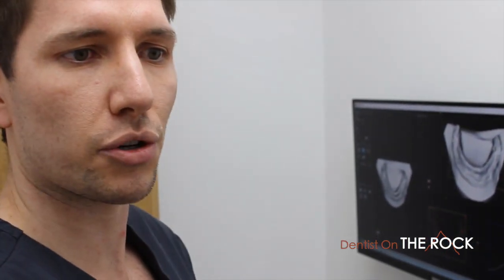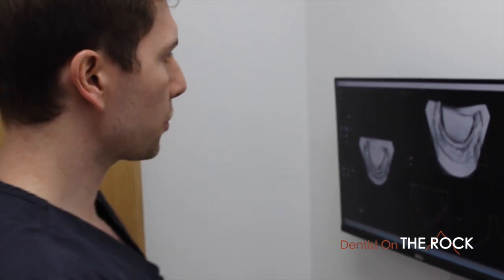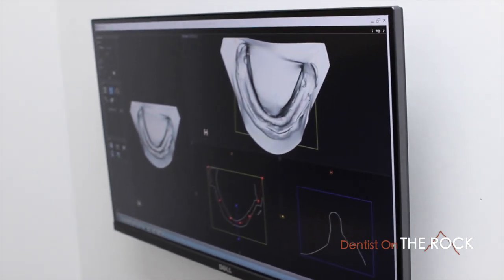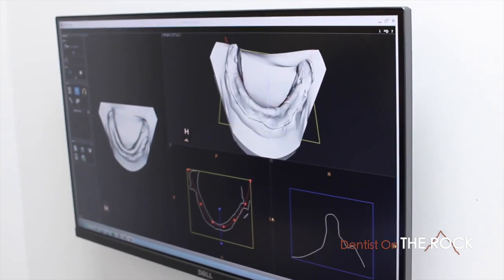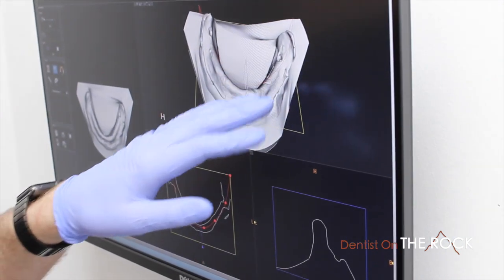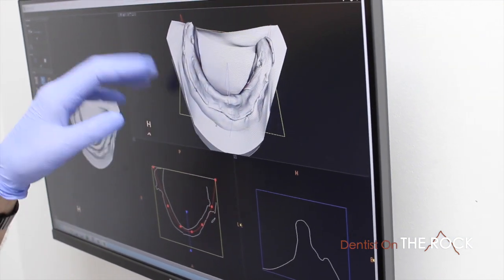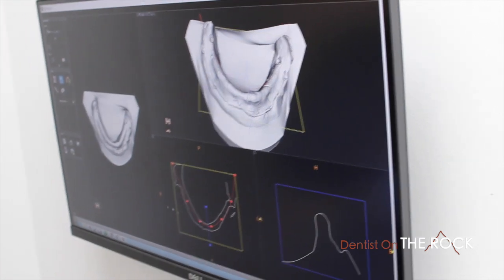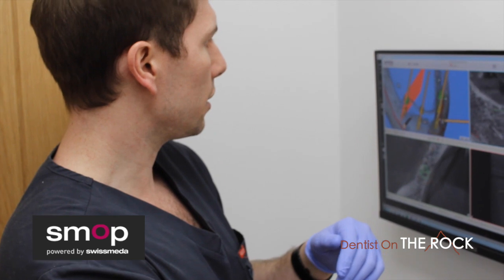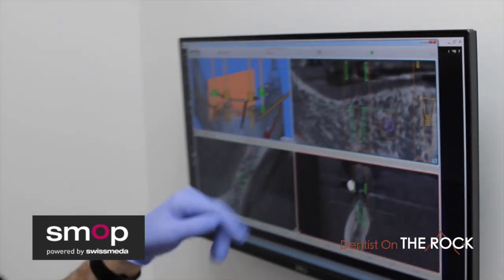You've seen how the model can be scanned on the machine, and here it comes up in CS Model. We can see a high-resolution scan of the fitting surface — we've got these indentations, beautiful margins, everything coming up here. You can view it with a model or without.